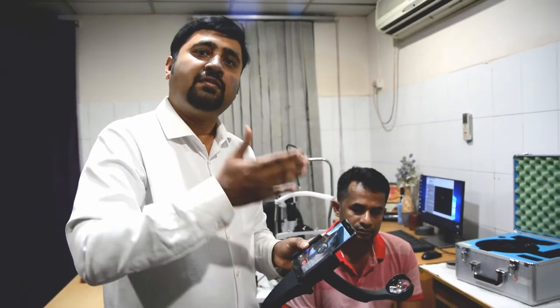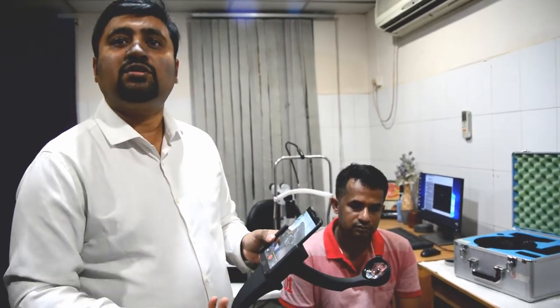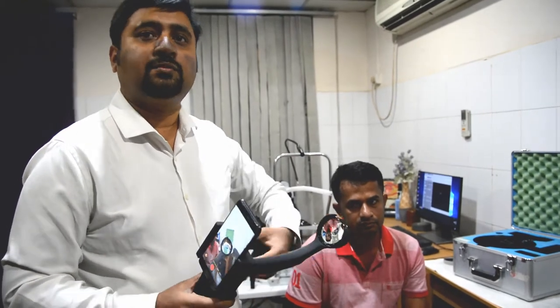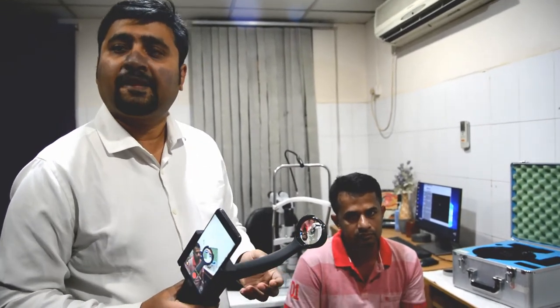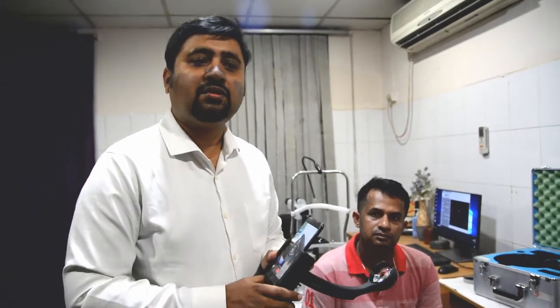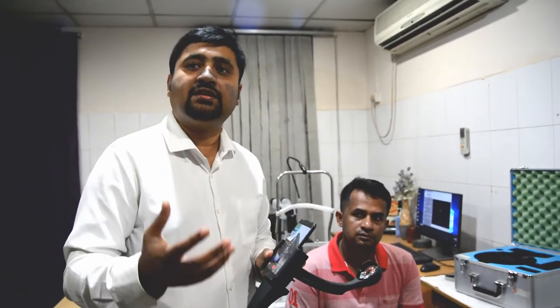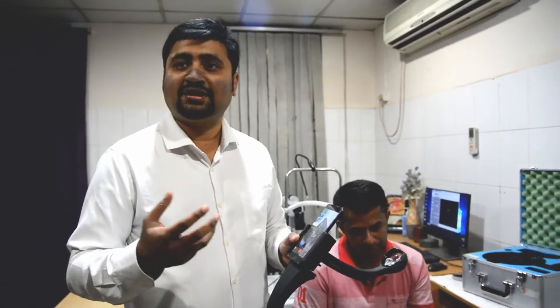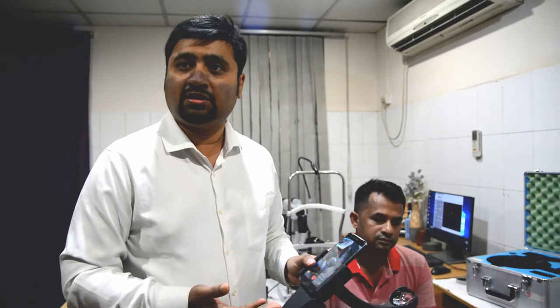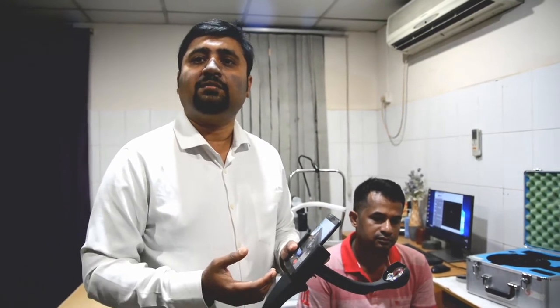What are the ideas of this device? This is a big issue — the device was very expensive. The device was very expensive, so the device was a very expensive device.